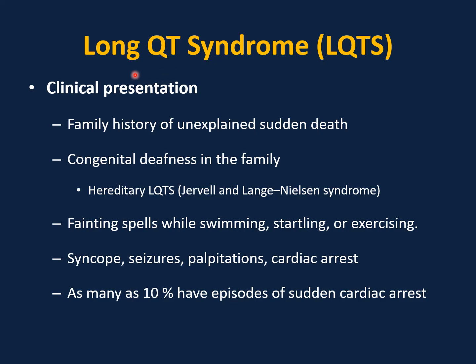Clinical presentation of long QT syndrome. Very important: if you have a long QT on the ECG or a history of syncope, we have to ask about family history of unexplained sudden death and congenital deafness in the family. This may suggest Jervell-Lange-Nielsen syndrome. Also, long QT syndrome may present with fainting spells while swimming, startling, or exercising. Syncope, seizures, palpitations, or cardiac arrest. As many as 10% have episodes of sudden cardiac arrest.